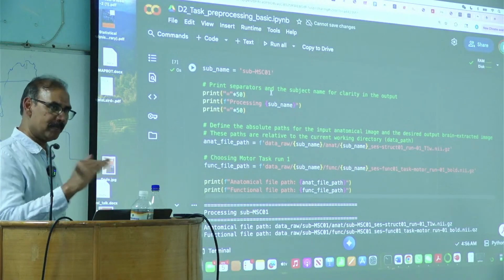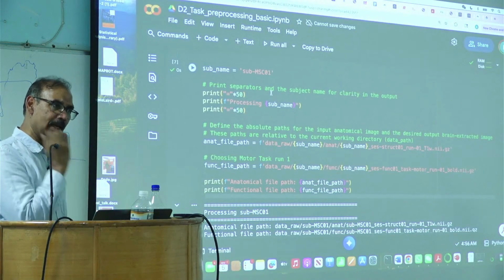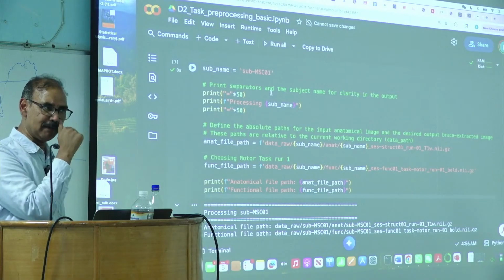Basically you just have to repeat the steps, but try to understand what is being done.